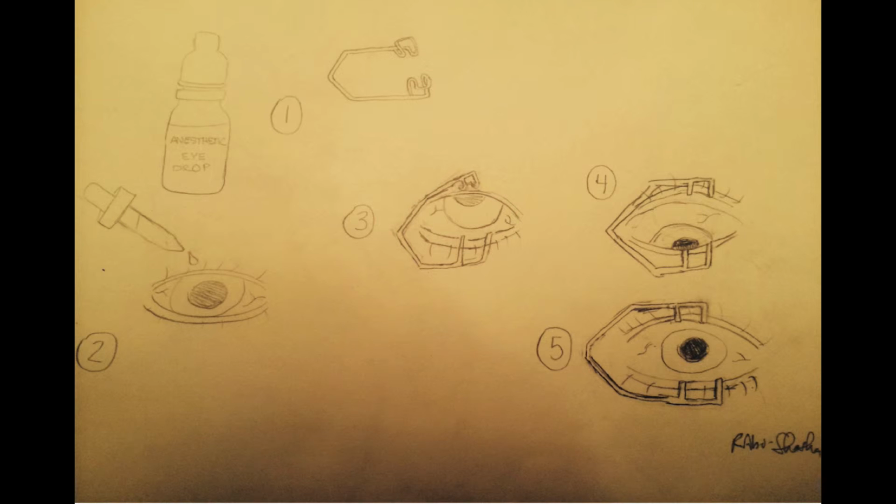In step number 3, 4, and 5, the key is to avoid touching the cornea. What I personally like to do is put in the retractor in the inferior lid first to reduce the chance of corneal involvement.